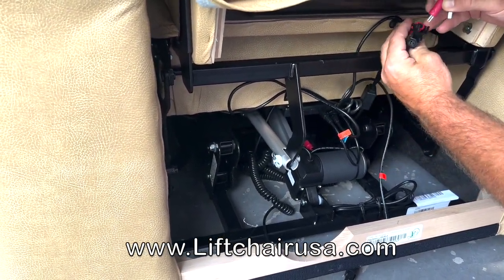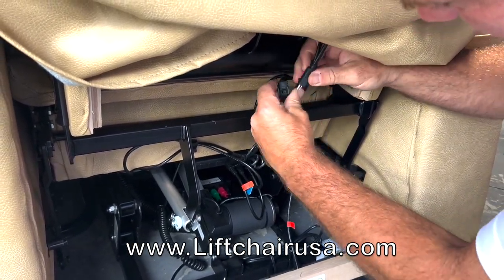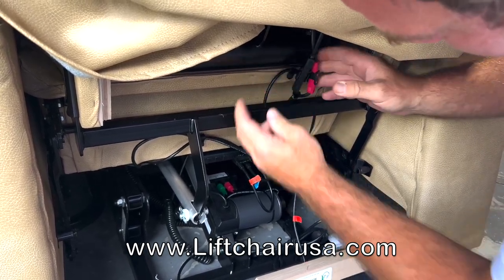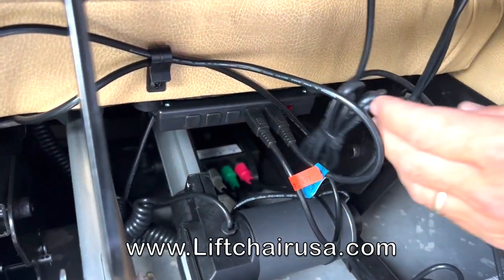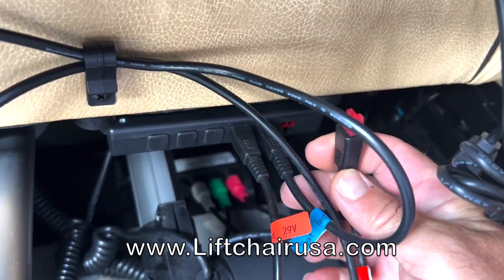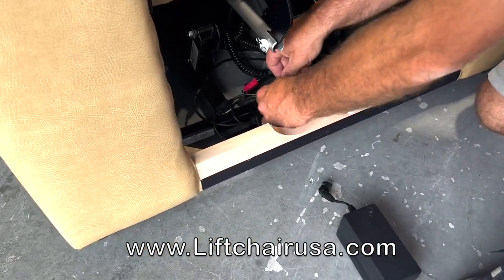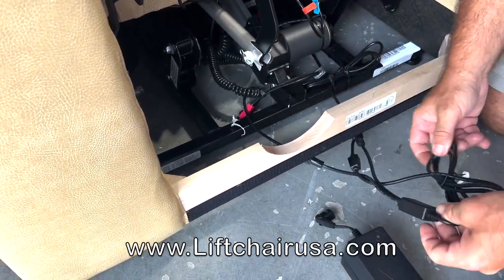We're just gonna plug red to red. Black to black. And then this right here is gonna plug right into this box. So just plug this in. This is your power supply, lithium battery. This is a reusable zip tie. Just push that button and slide this out. We're gonna come underneath the chair.